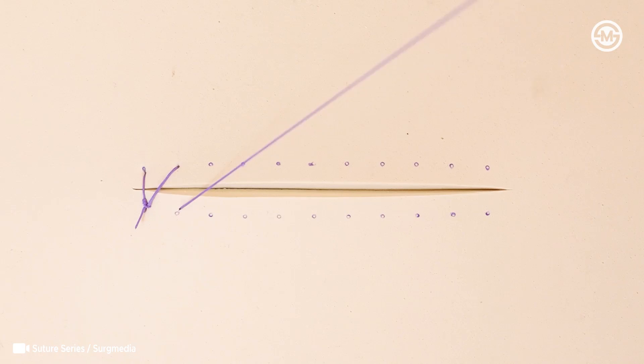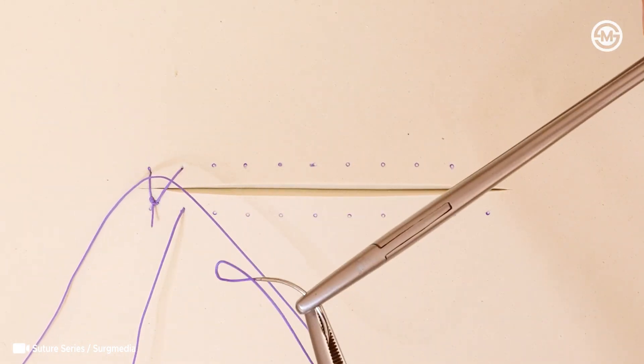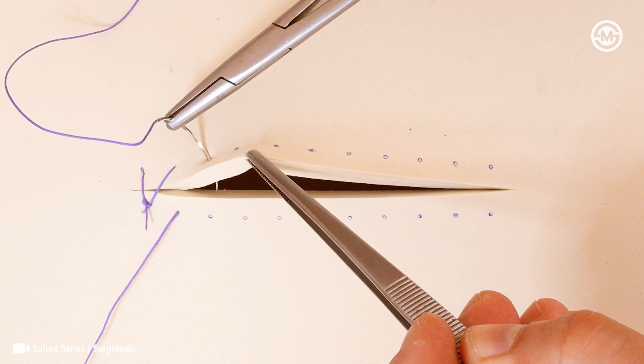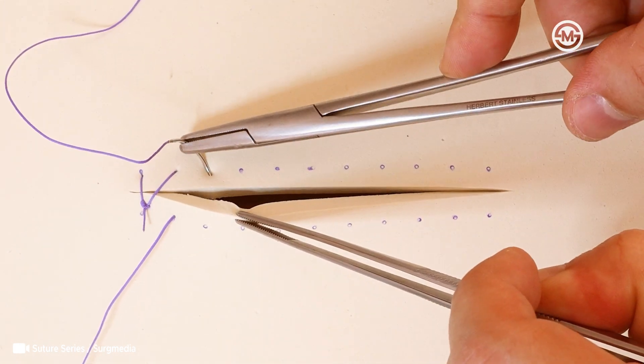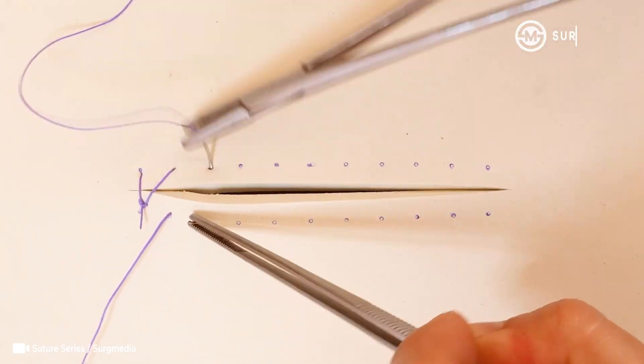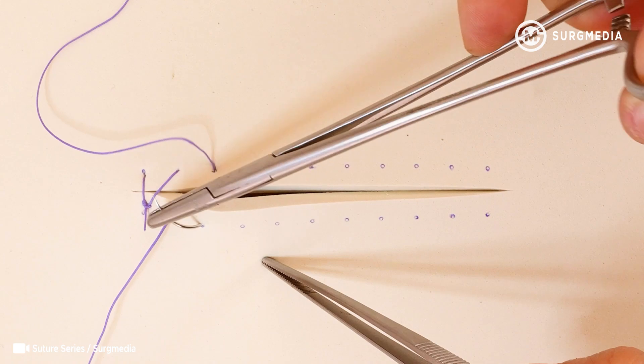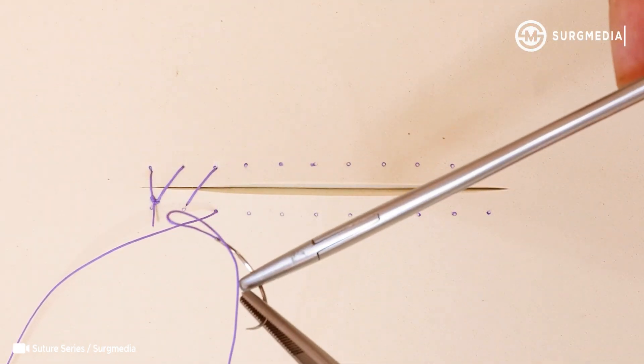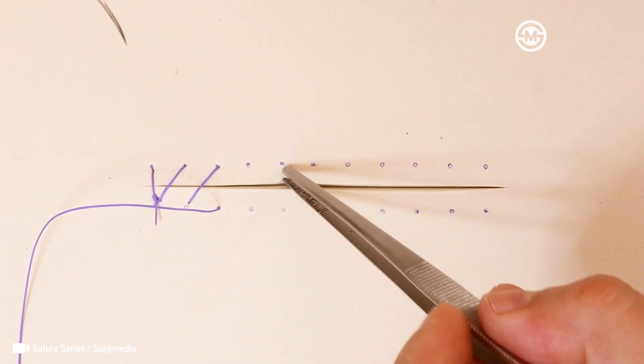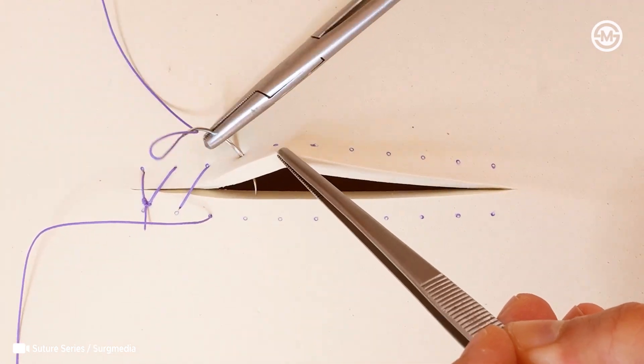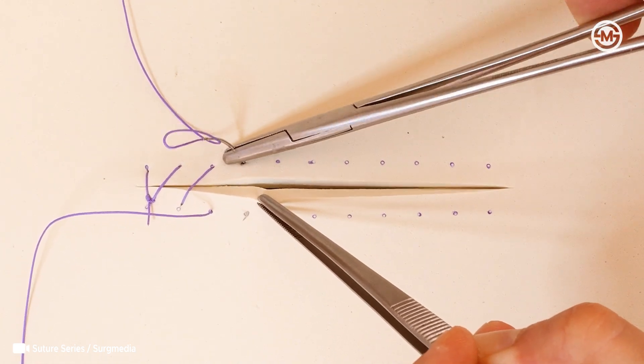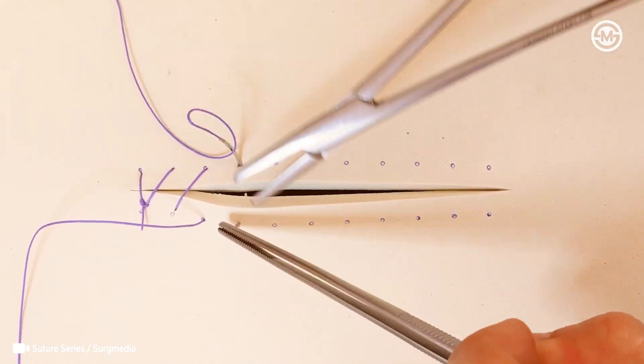To start, we place the first stitch and tie a square knot to anchor it. Then we trim off the extra thread. From there, we move down the wound, placing evenly spaced sutures without tying knots in between. To finish the suture line, we can tie the final knot directly to the last loop, or cross to the other side, similar to the vertical mattress technique. It's quick, it's clean, and it looks neat when done well.